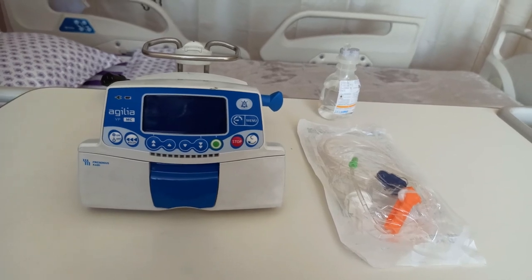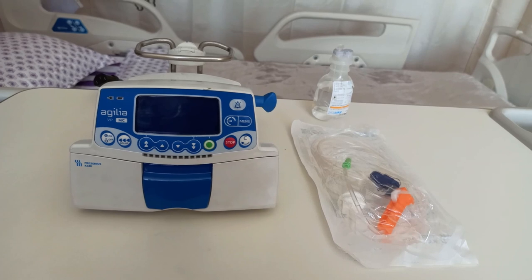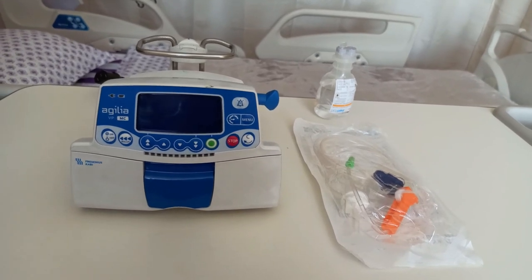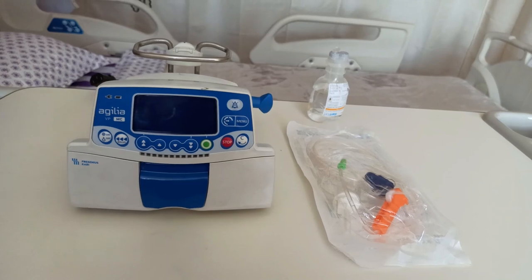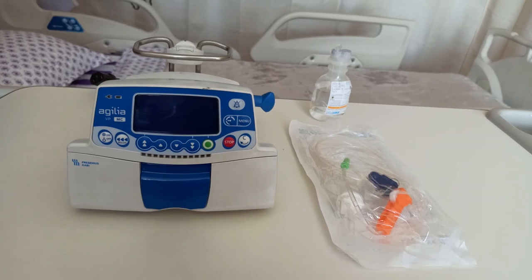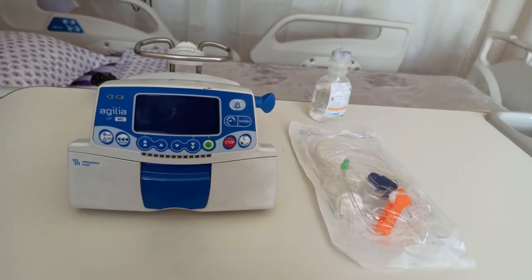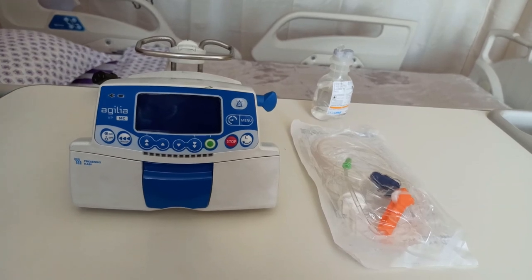It is quite different from its elder sibling the Optima VS, which we are used to seeing and operating. One of the main points to notice is the compatibility of the infusion lines. Unlike other infusion pumps which accept any infusion lines — JMS and B. Braun Intrafix, to be precise — this pump only accepts a single dedicated line, which is the Volumat line.